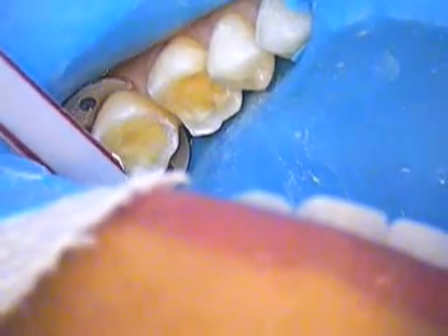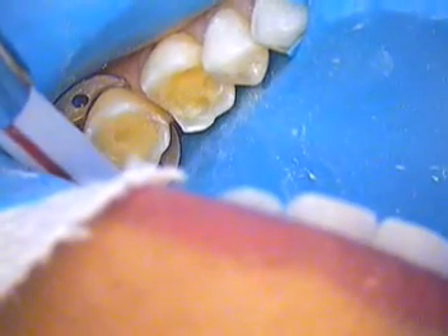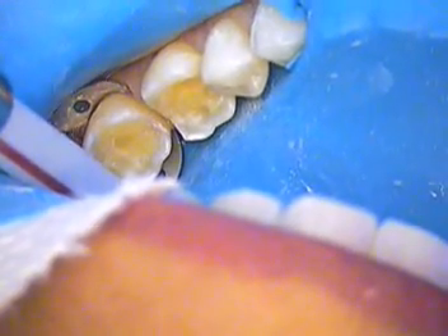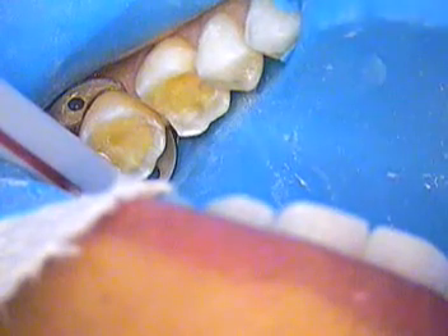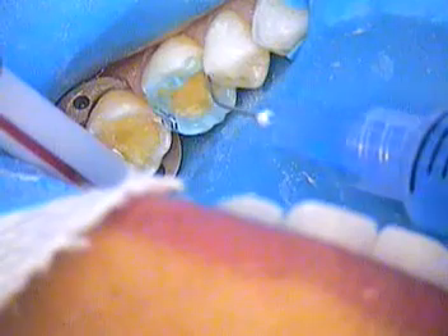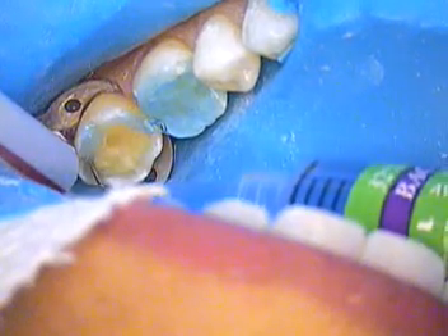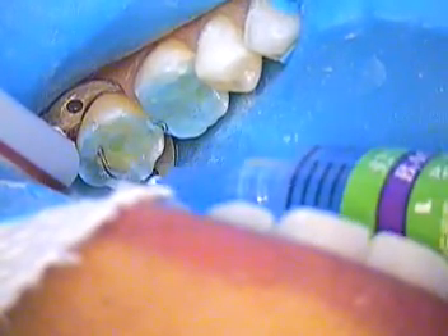We're going to use our etch now — we have the blue etch material. We'll start off on the enamel, all the way around, then come right in here on the dentin, all the way around.